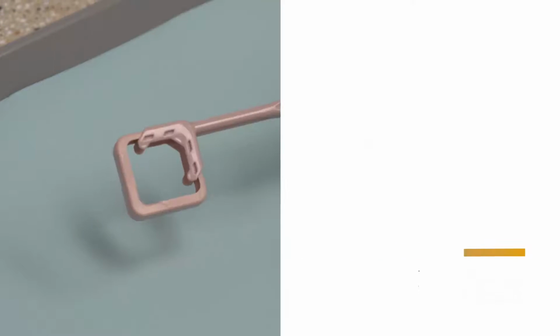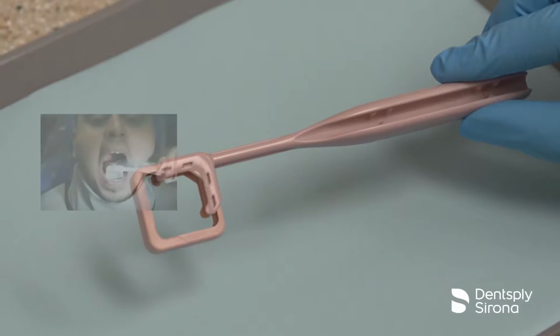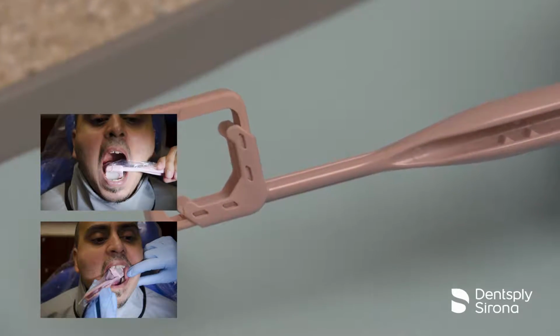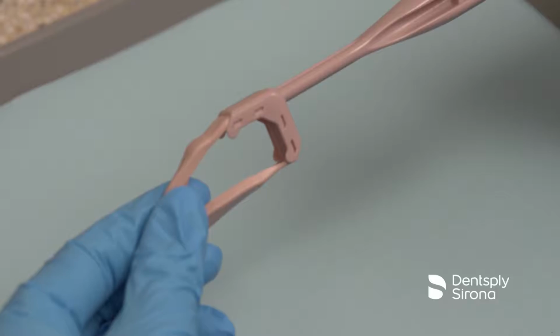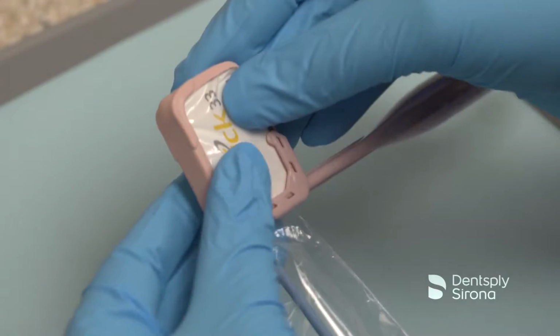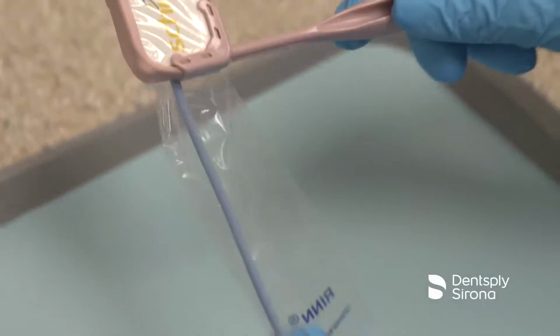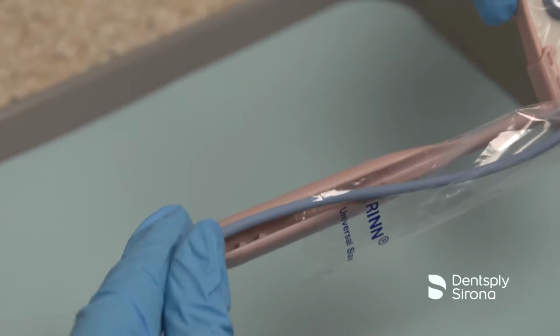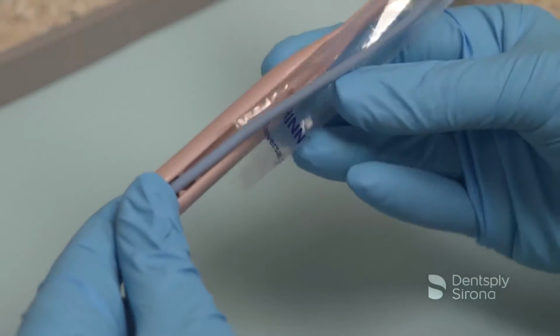The ComfortWand holder is an autoclavable holder indicated for both vertical and horizontal periapical imaging where there is limited room for a bite block, such as pediatric or endodontic imaging. The soft elastic strap cushions the hard corners of the sensor and secures size 1, 1.5, and size 2 sensors, while the recessed slot in the handle tames the sensor cord.